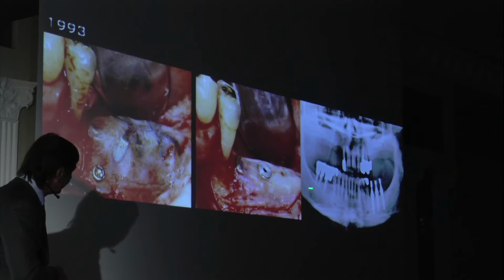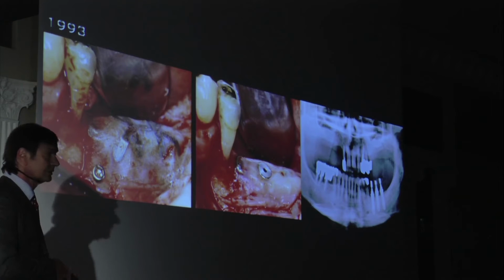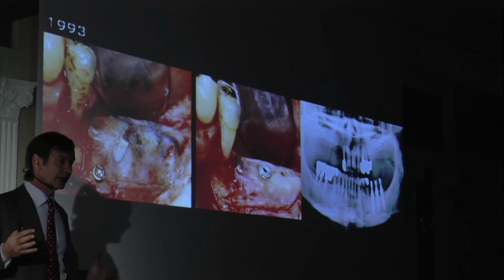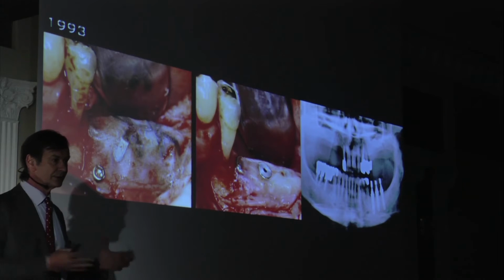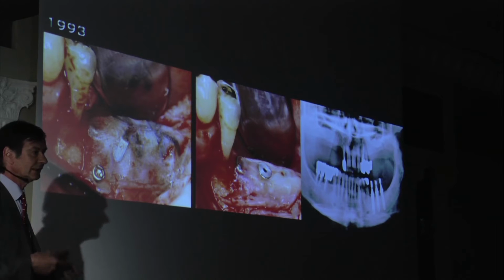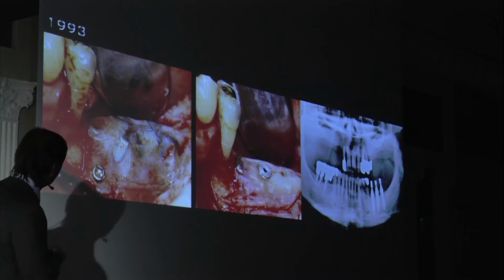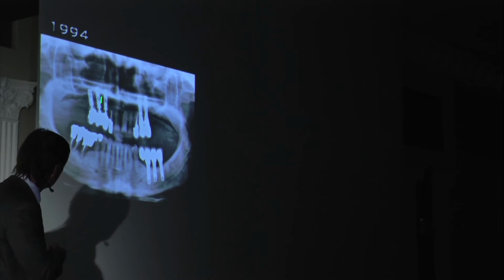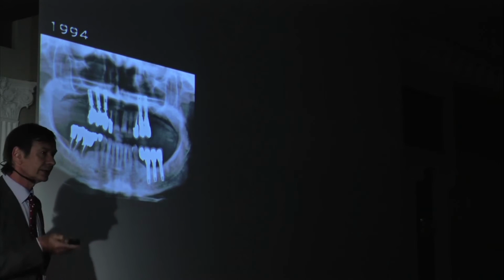And if you look at this situation of the teeth, these teeth were really compromised, but the patient ran out of money, so she didn't want me to touch those teeth. So we continued to root plane these teeth forever. And if you look at the situation, in '94, we have the bridge in place everywhere, and the teeth are still there.